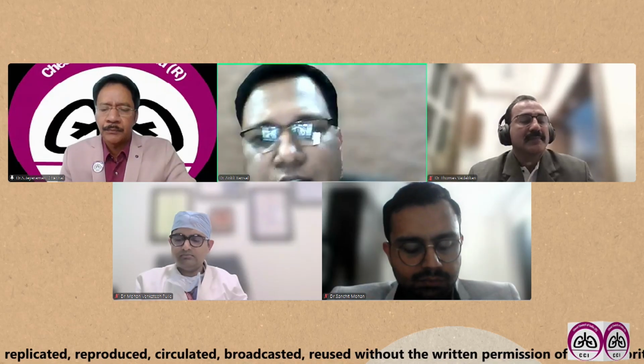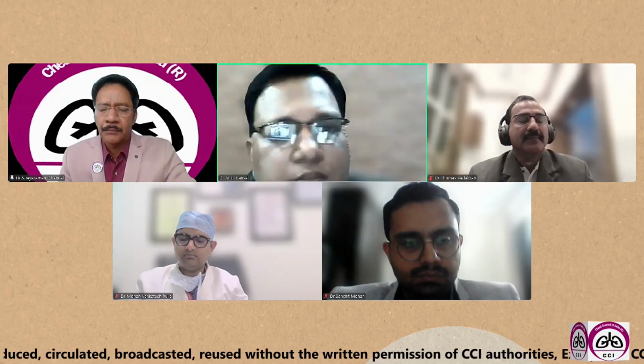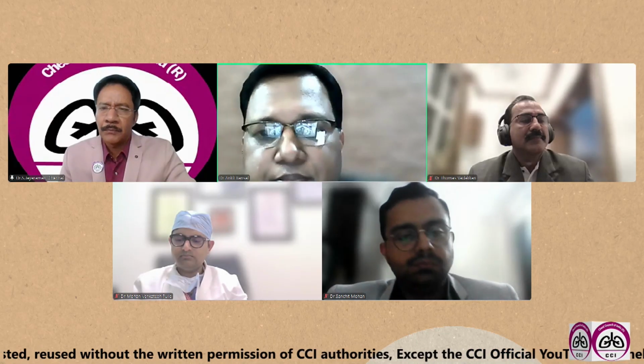Besides this, suppose there is a complication of vessel puncture, then it can cause a catastrophe on your table. It could be airway hemorrhage, you need an emergency intubation and something like that. So if there are difficult stations, definitely the safety of the patient comes first.